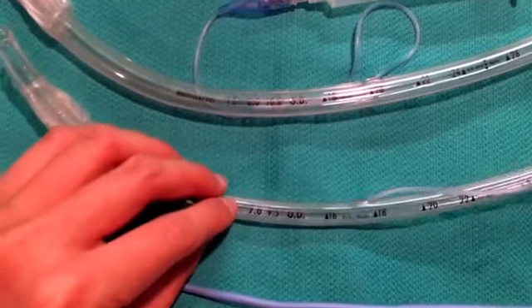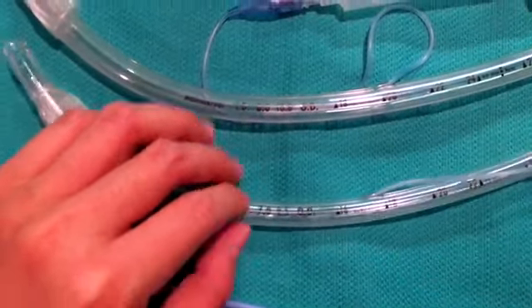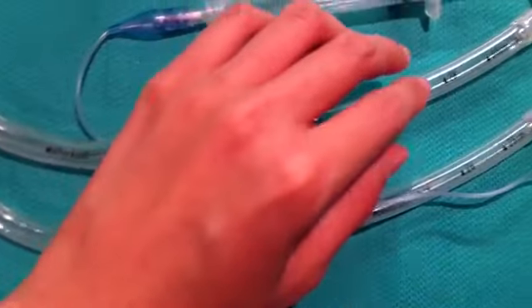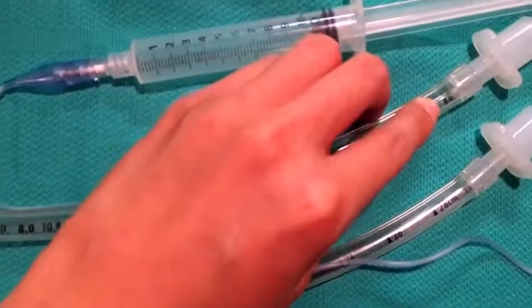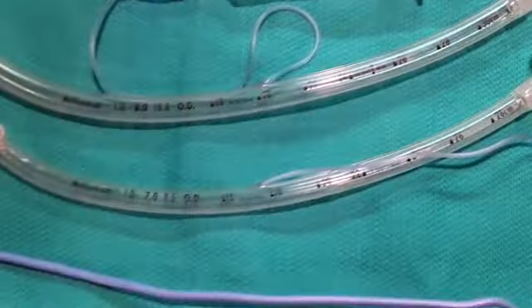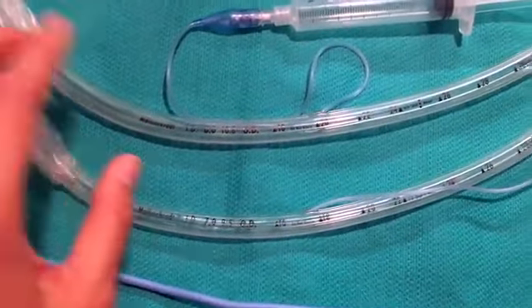One way to tell the size is to look at the bolded number right here. That tells you the size of the ET tube, 7 and 8. It also can tell you up here towards the tip, if you want a quick and easy way to tell what size you're using. So basically, the anatomy of the ET tube.